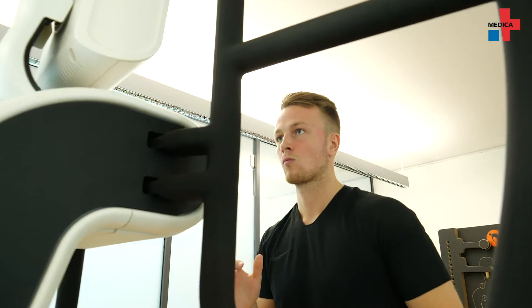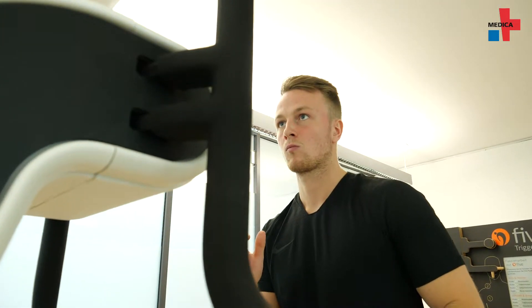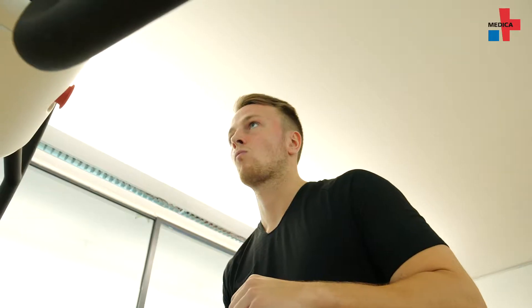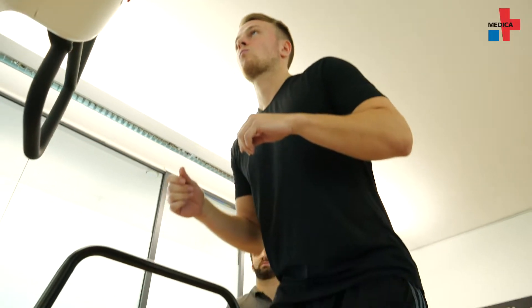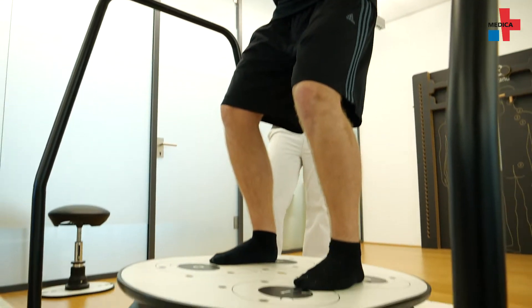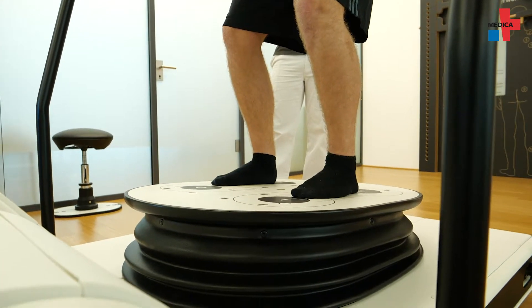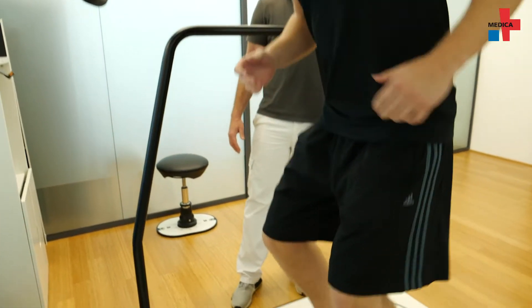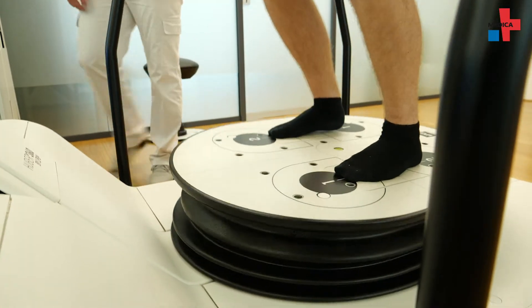The Huber 360 trains three areas. In the movement area, the doctor adapts the training to the condition of the limbs, fascia, and muscle bands, and increases the radius of movement. He normalizes stability and control, and in the area of strength building optimizes coordination. There are no negative side effects during training.